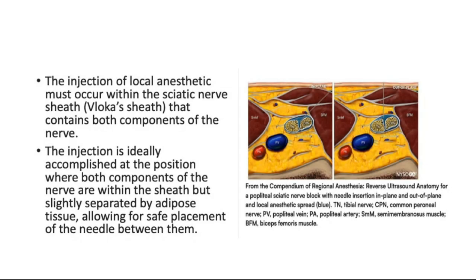When we have anatomical variation, or when we have difficulty viewing the nerve, it's always good to confirm. Rather than just putting the probe there, having a transverse section of the image, and guessing which is which, it's better to just trace the nerve up and down. Safer.